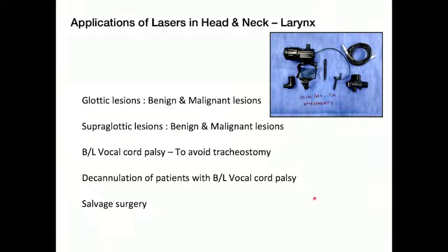It starts with getting the beam working at the first point. I think that's the most important, getting the attachment fixed. These are very, very fine instruments, and you need to handle them like a baby, like any other instrument. Because if you don't put the coupler properly, you don't align your coupler and the microscope properly, you will not have a beam. So initially when we started the operation today, we had some time to get the beam into your area of operating field, right? So it's very, very important to understand that.